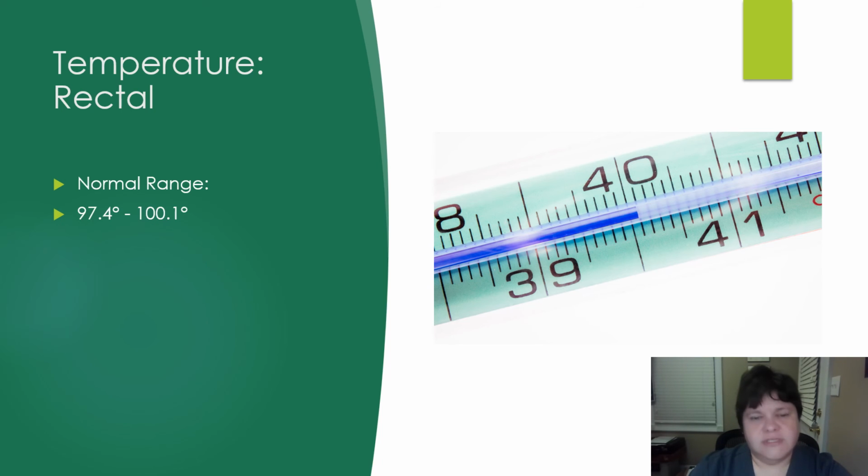And I stopped the student and I asked him, "Did you just take an oral temperature?" She said, "Yes." And I said, "Did you use a probe cover on that?" And she goes, "Well, yeah, of course." I said, "That's a good thing. Remember, the red tip thermometers means rectal." I don't think she made that mistake again.